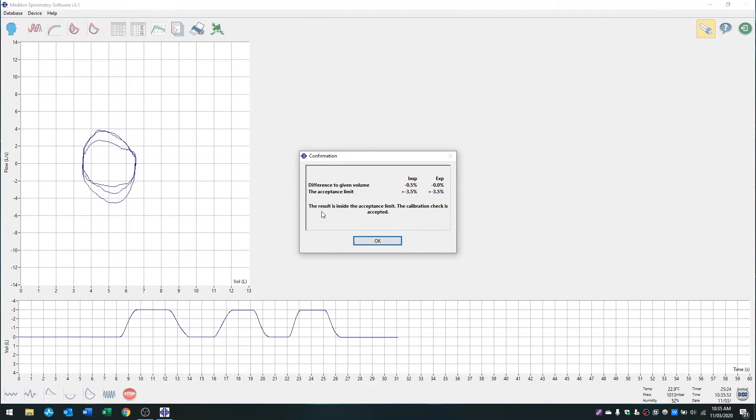If for whatever reason you get red text that says it's outside of the acceptable limits, it's likely one of two things. One is that the mouthpiece is not firmly inside the syringe, and the other is that you've got the incorrect calibration code. So just check that and try again.